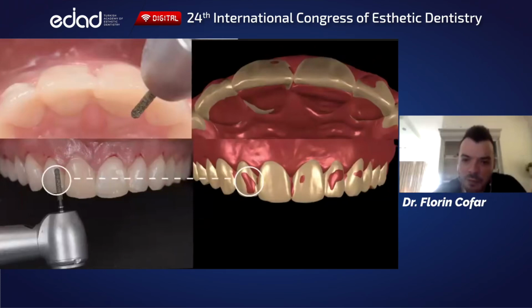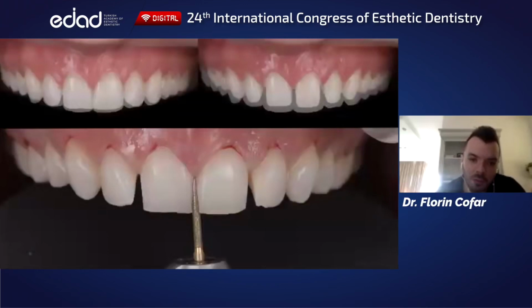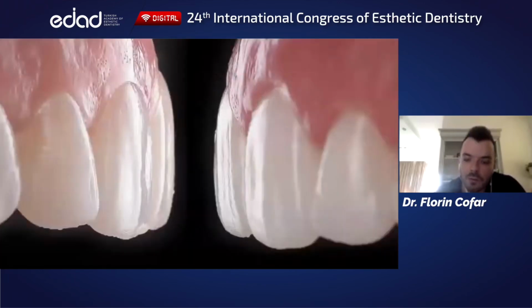The thing here, you don't need to be accurately precise to 1/10 of a millimeter, because it's a pre-prep. It's not the actual prep. Just cut so you can place your library in the final position. This is your ideal design, and based on this you will do the actual prep. Here, either use APT by Galip or use a silicone guide, or both. It doesn't really matter.